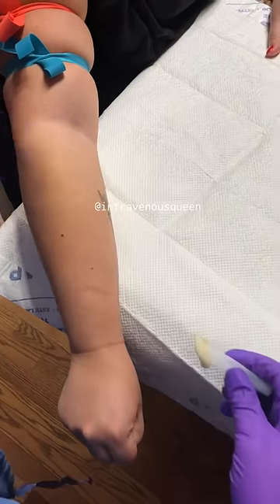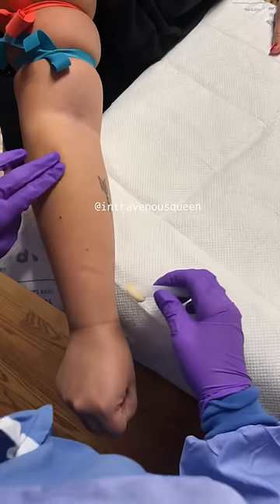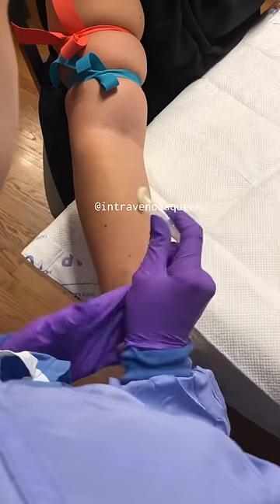Really take notice at how I use my left hand along with my right hand. With the left hand I'm holding the skin, and this is also helpful with patients that have a lot of wrinkles.